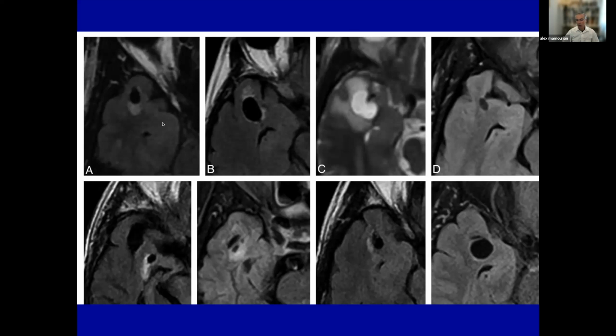But as long as you are open to the idea in your reporting that this could be unrelated to the seizures, and that this is a reported benign finding, then I think it puts the clinicians on the right track. But yes, there could be an overlap in imaging with this appearance and the consequences of trauma, with the vulnerability of the anterior temporal lobe in trauma cases.